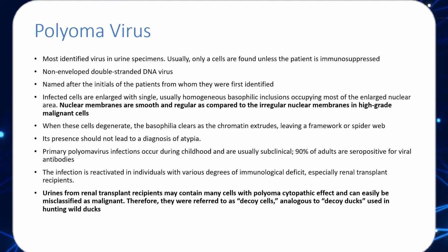The term was coined by Andrew Ritchie. He was a cytotechnologist in Sloan Kettering across the street from us, and it reminded him of decoys, which are used in duck hunting. So again, this term has been used mostly in the books that have come up after this was initially coined. So that's something that you need to look for.